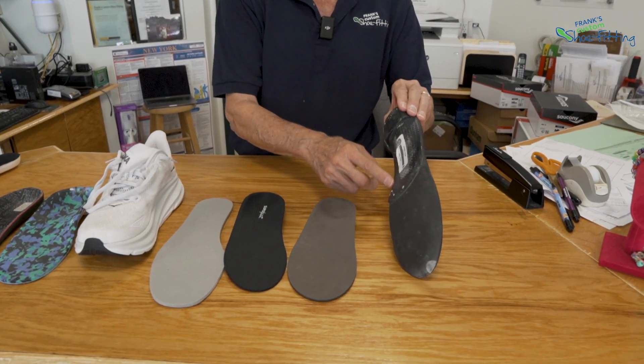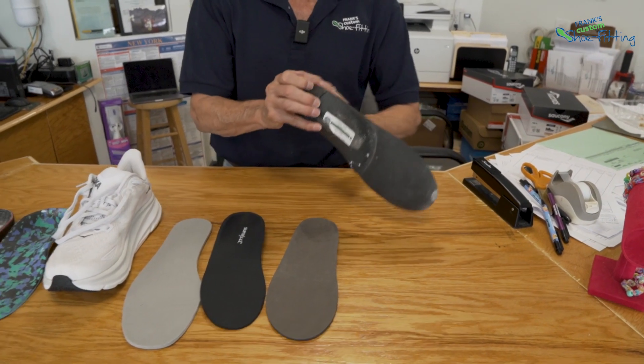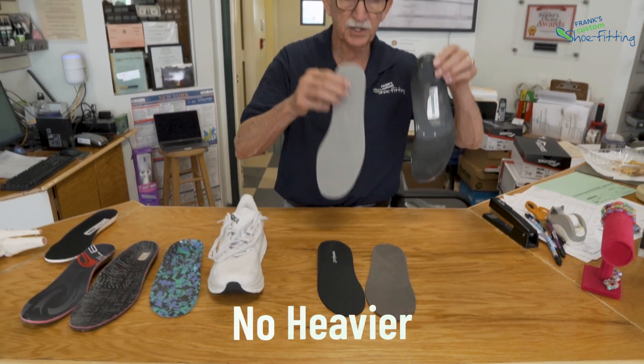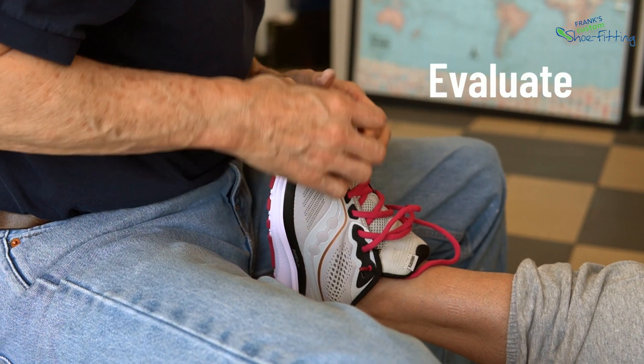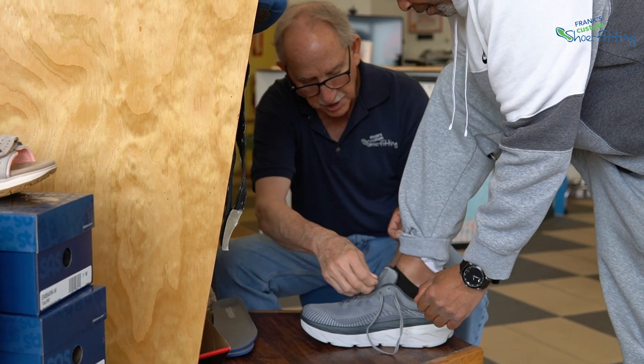We like material that is hyper thin and very lightweight. In the end, we like the whole device to be no heavier than what came out of the shoe and no thicker, so we don't mess with the fit of the shoe. If you want us to evaluate the way your shoes and orthotics are fitting, or feel like you need our help or want to get fitted, we're here to help.